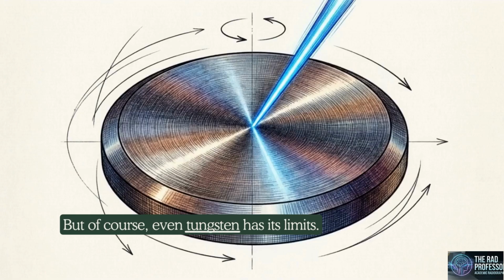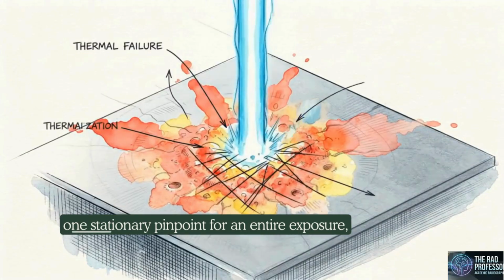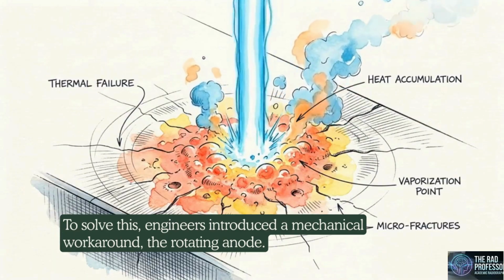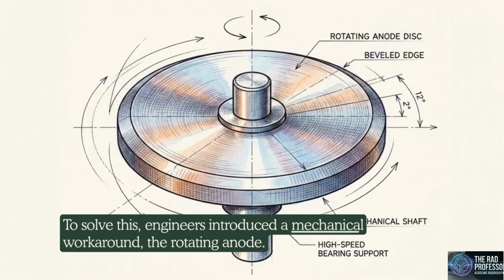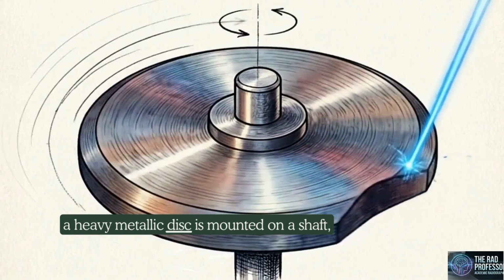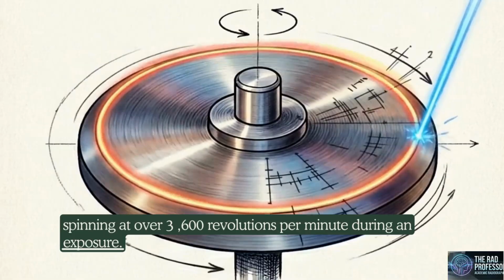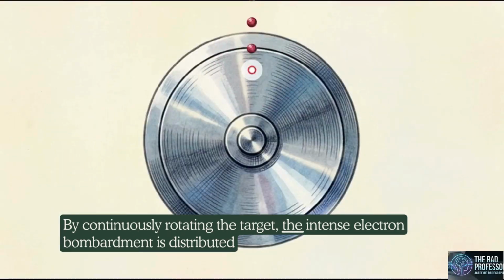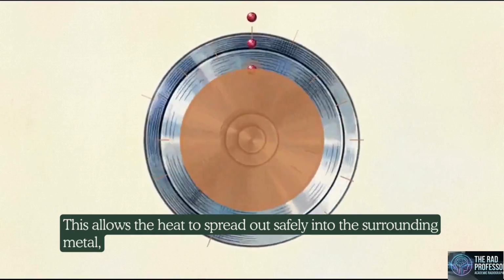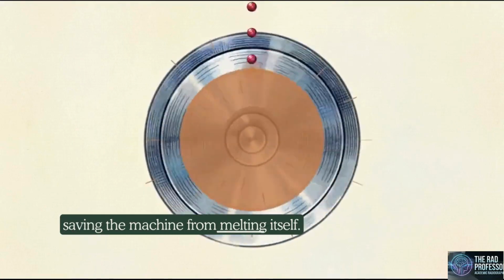But of course, even tungsten has its limits. If millions of high-speed electrons continuously bombarded one stationary pinpoint for an entire exposure, the metal would pit, crack, and vaporize. To solve this, engineers introduced a mechanical workaround, the rotating anode. Inside the vacuum tube, a heavy metallic disc is mounted on a shaft, spinning at over 3,600 revolutions per minute during an exposure. By continuously rotating the target, the intense electron bombardment is distributed along a large circular track on the face of the disc. This allows the heat to spread out safely into the surrounding metal, saving the machine from melting itself.